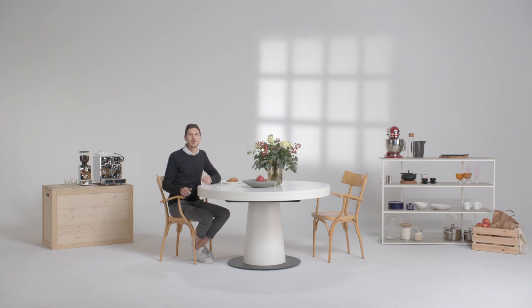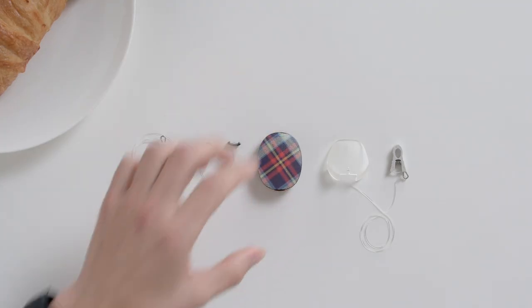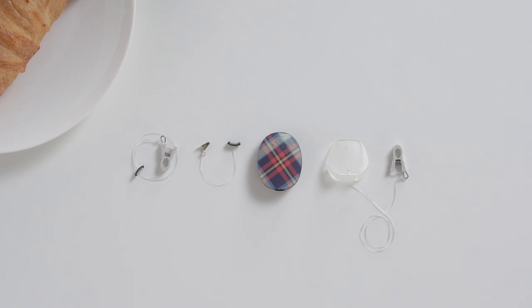In this video I'll show you how you can use different attachment clips to keep your RONDO 3 audio processor secure. There are three different attachment clips for RONDO 3: the hair attachment clip with bracket, the closing attachment clip with bracket, and the clothing attachment clip with cap. These can be used for extra security and peace of mind.